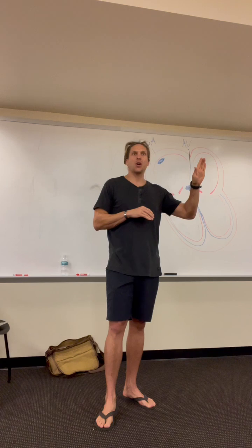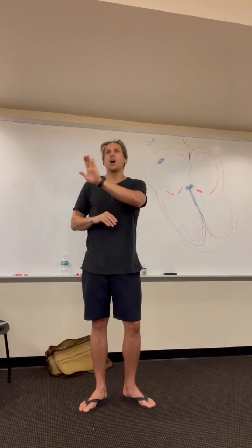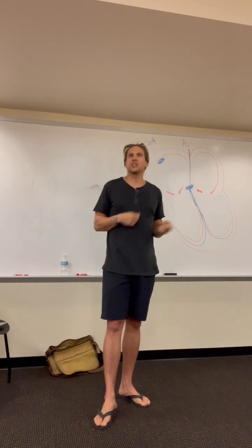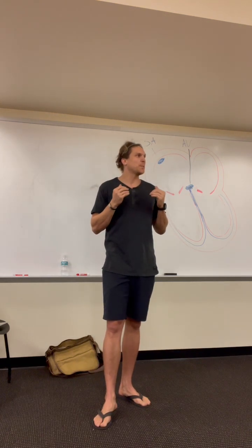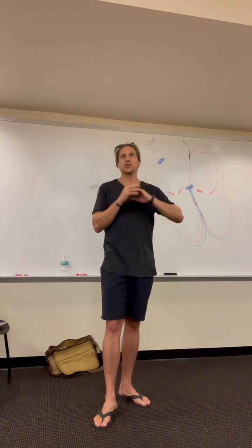Is their pH off? Is it a kidney or a lung issue? Is it compensated? Are they hypoxic? And that gives you the full answer. There's a systematic way to read EKGs, okay? She has it listed on her slides.